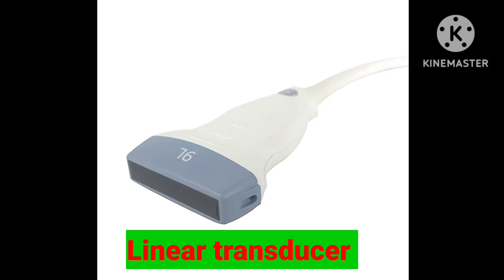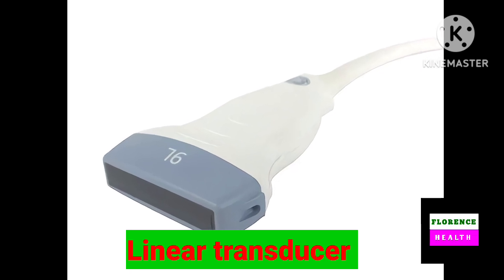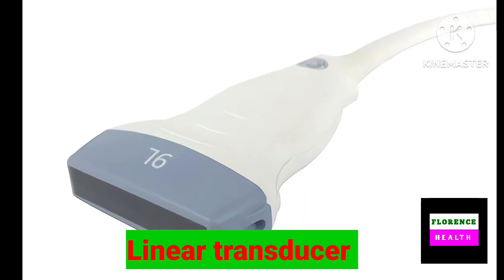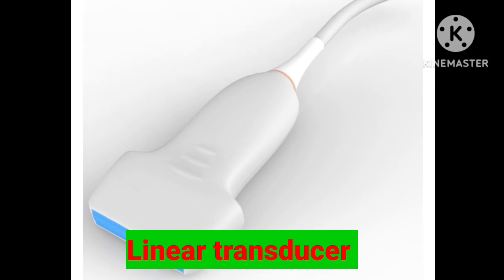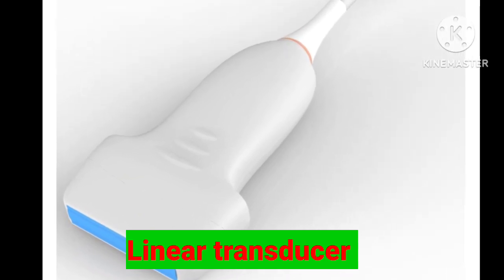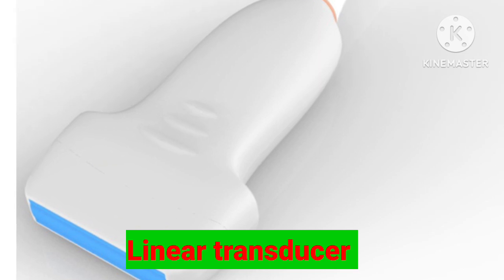This slide showing linear transducer. As the name suggests, one end of the probe is straight, that is linear. It uses higher frequency, in between 6 to 15 MHz. It is used for ultrasound examination of peripheral organs, that is superficial organs like thyroid, breast and scrotum, and ultrasound examination of peripheral arterial system and peripheral venous system.